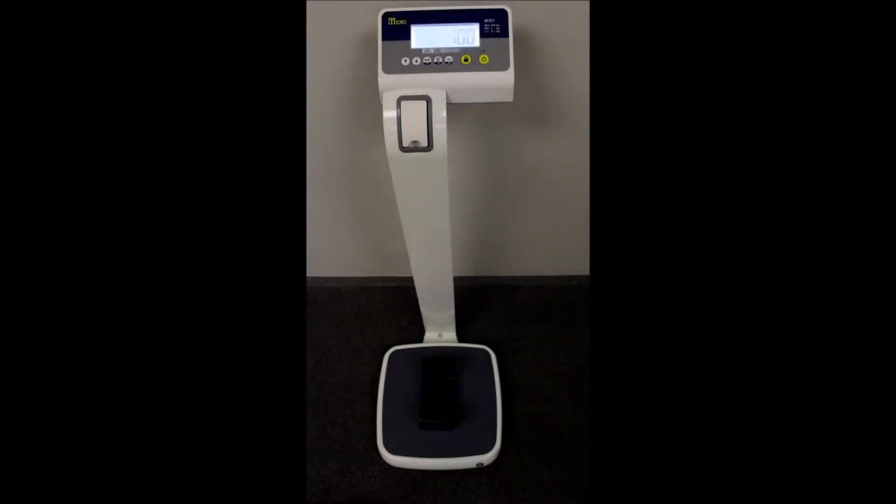This is a micro personal scale model M301. Capacity is 250kg x 100g. It's battery operated and works off mains.